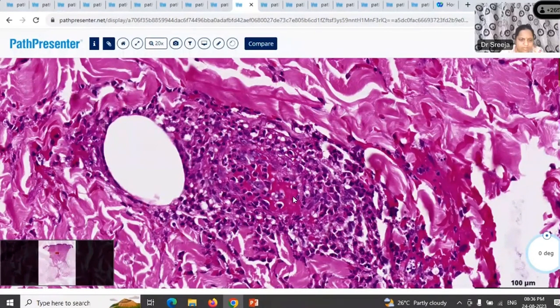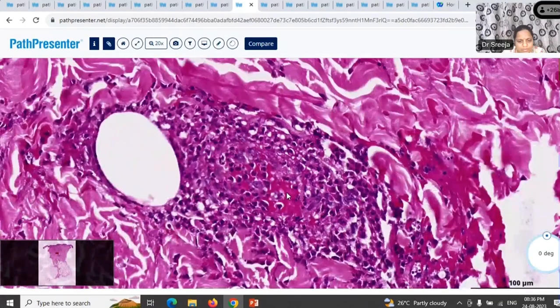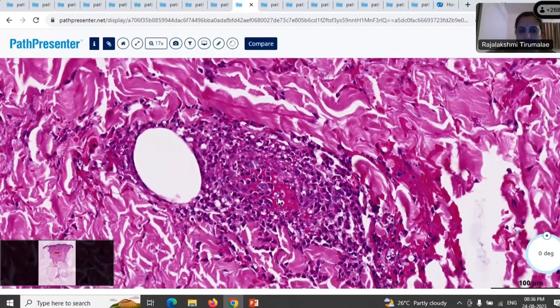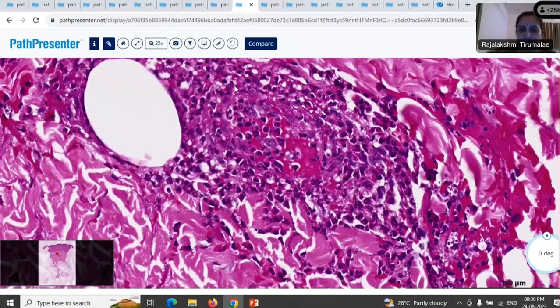What has happened to the vessels? Do the vessels look... so far you saw so many cases of perivascular dermatitis. Inflammation. Did not see any changes in the vessels. Inflamed blood vessel, ma'am. What do you mean by that? Can you explain the changes that you're seeing here? In addition to the infiltrate, what has happened?